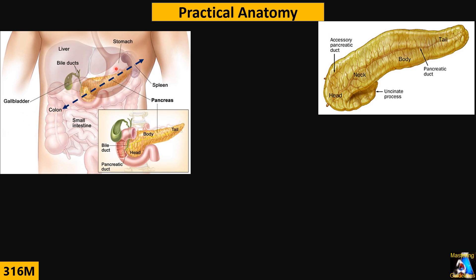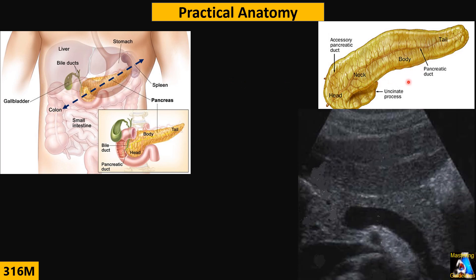The pancreas is oriented almost along the alignment between two and eight o'clock. That is the reason when we scan and want to see all of the pancreas including the tail, we place the probe transverse and then twist clockwise so our probe orientation is almost between two and eight o'clock.